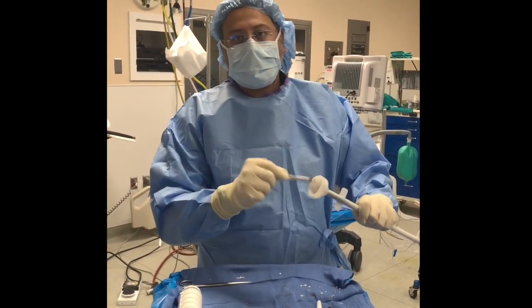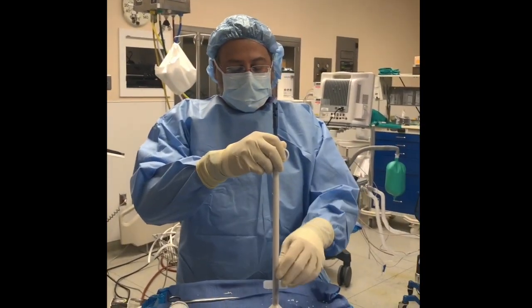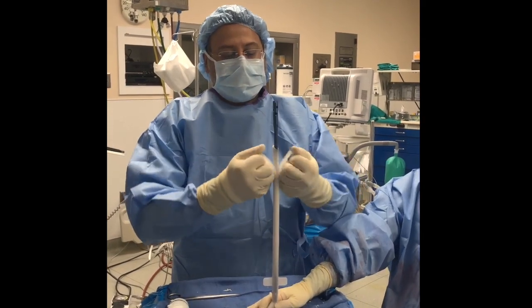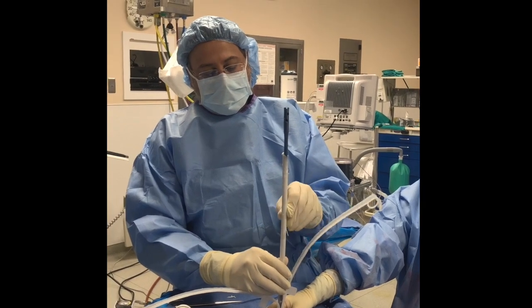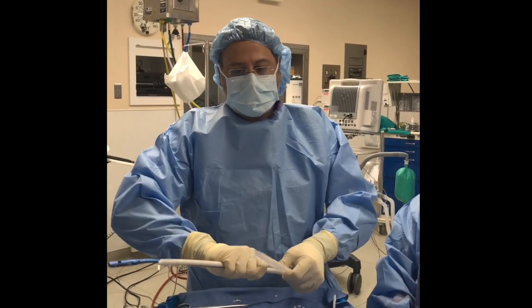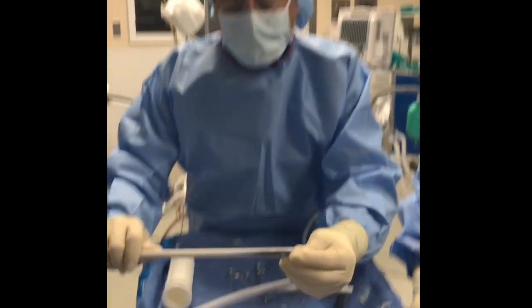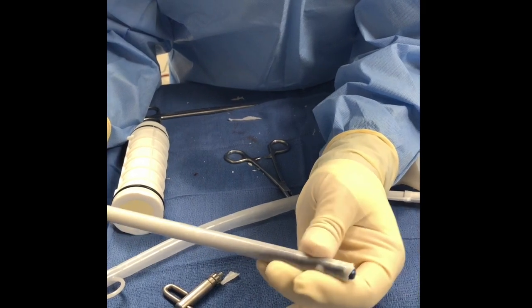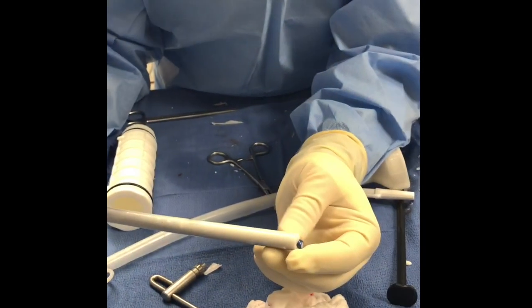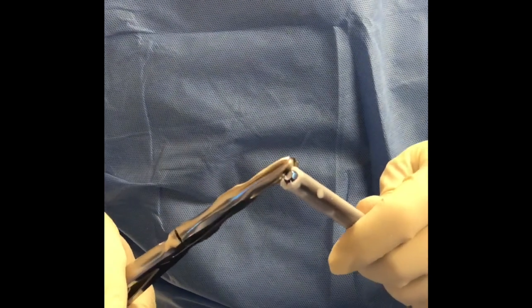I can tell here that this is nice and hard. I'm just going to hold the bottom of it and do this — and that just comes right off. From the bottom it just does this. There it is — show it close up. Now the locking holes are covered, but I can lock this right through the cement, and you can see it on x-ray. The question is, is it evenly distributed on the nail? It's not. We have little spacers that can do that, but I don't use them because I don't think it really matters.